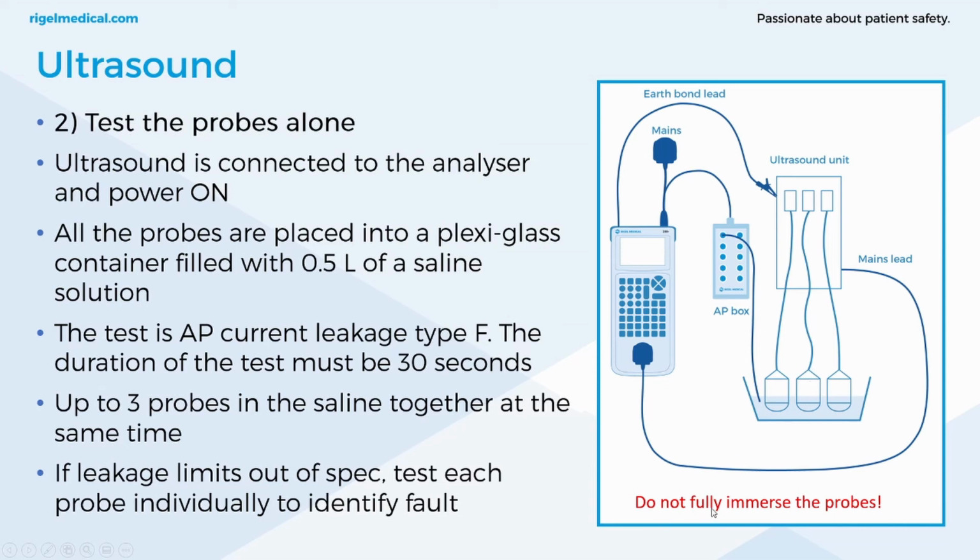One thing to note is to not immerse the probes fully. We're just immersing the probes to a point where we think there will be patient or user contact. It's always important that you don't submerge these fully. Okay, so the duration of the test must be 30 seconds, and that ensures that any saline gets a good contact between our electrode here and any ingresses that you might find within the ultrasound transducer.